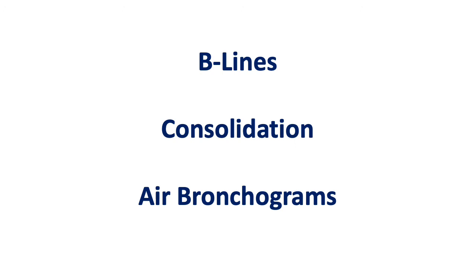So we've seen all of these findings: B-lines (both simple and confluent), subpleural and deeper/larger consolidations, and both dynamic and static air bronchograms. There is no single finding that is a signature appearance of COVID-19 infection — all of these could be found in atypical bacterial infections as well as different viral pneumonias. We need more data to determine which findings are more suggestive of COVID-19 and which can risk-stratify patients. Fortunately, many people including our own ultrasound group are researching those questions.